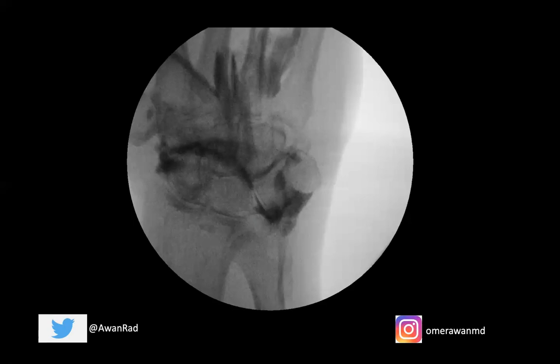The lunotriquetral ligament is thickest along its volar aspect. The volar aspect is usually trapezoidal in shape, as we see on MRI. The central portion is usually triangular in shape, and the dorsal aspect is more band-like. When you tear the volar aspect, that's more important for stability and can be a significant problem. This is a nice example of what a lunotriquetral ligament tear looks like.